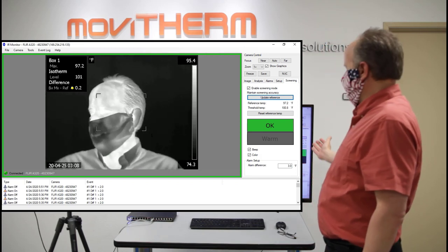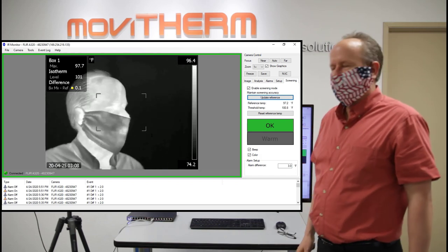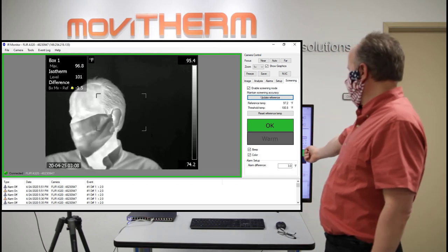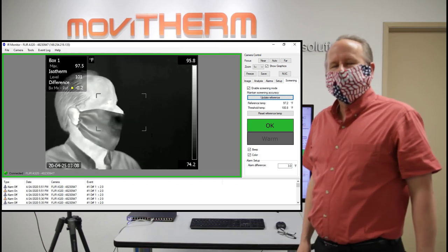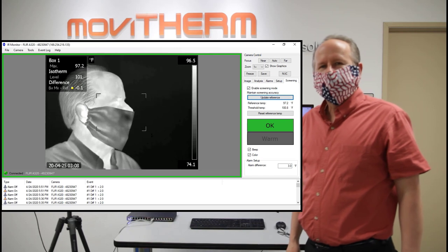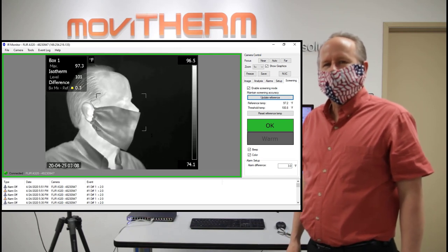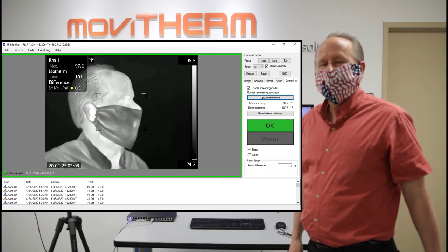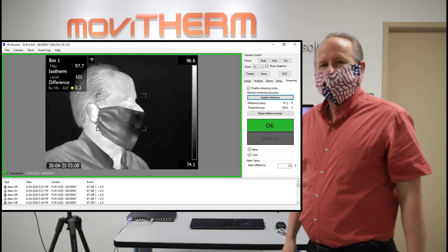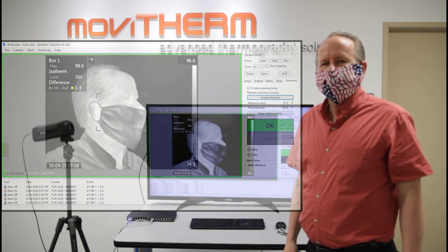And what I'm going to be doing now is actually artificially warming up my tear duct areas, and I will be simulating an alarm situation.